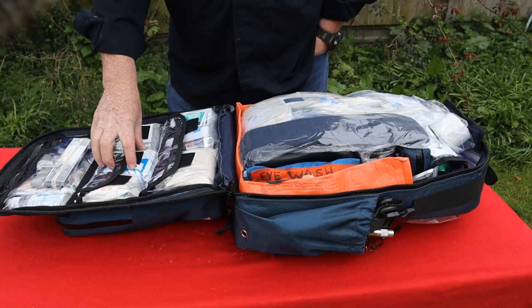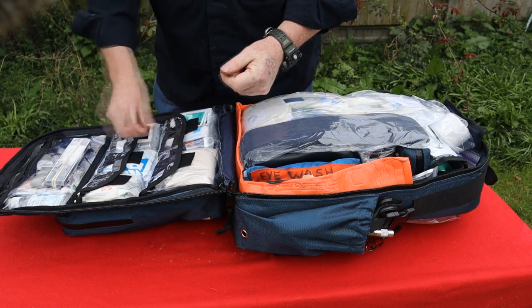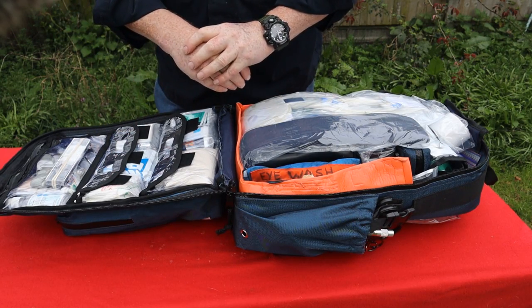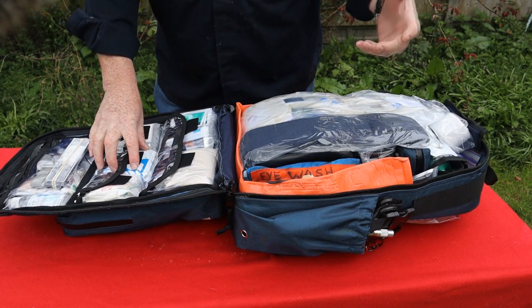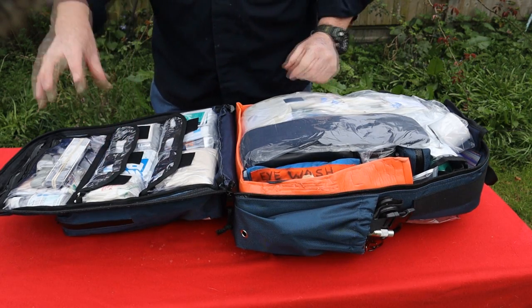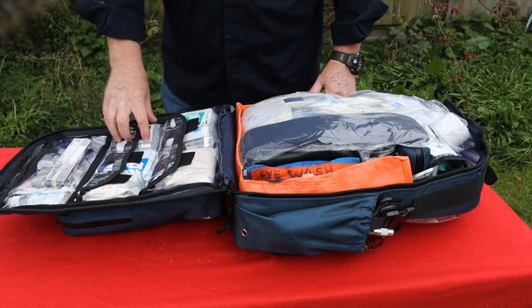Chemical ice packs, so 2 chemicals, crystals inside. You literally just kind of pop the crystals inside the bag, chemicals mix and it becomes very cold. So we're trying to reduce swelling, inflammation. You know, it's a step up from the magic sponge for footballers and all the rest of it. So cold packs. Next to those, space blankets.